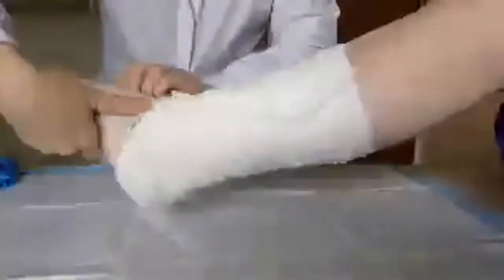So you want to start out, bring your ace wrap around, and you'll want to make certain that you cover up that Velcro strap and have it adhere to itself. Then bring it down to the foot here. Bring it on around. You want to make certain that you're covering that. Then you want to bring it up. You kind of start doing figure eights back and forth, up and down the leg.